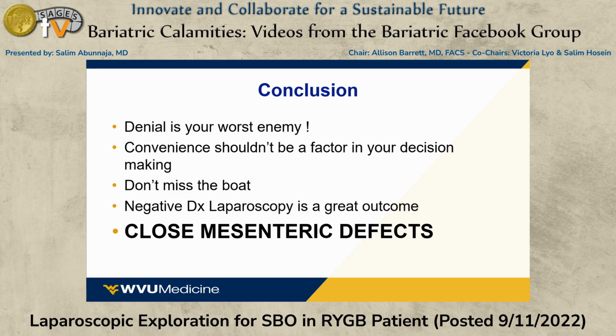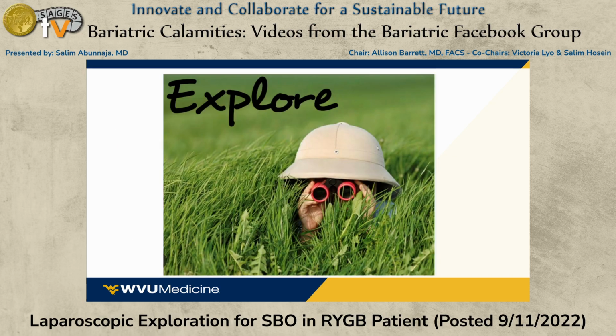And please, for God's sake, close your mesenteric defects. The bypass was done in 2019. Why are the mesenteric defects not closed? And with the bypass patients, I always say, I don't know how many scenarios you can think of where you don't explore a bowel obstruction with a gastric bypass patient. I can't think of anything. So if you have a bowel obstruction with a bypass patient, please explore.